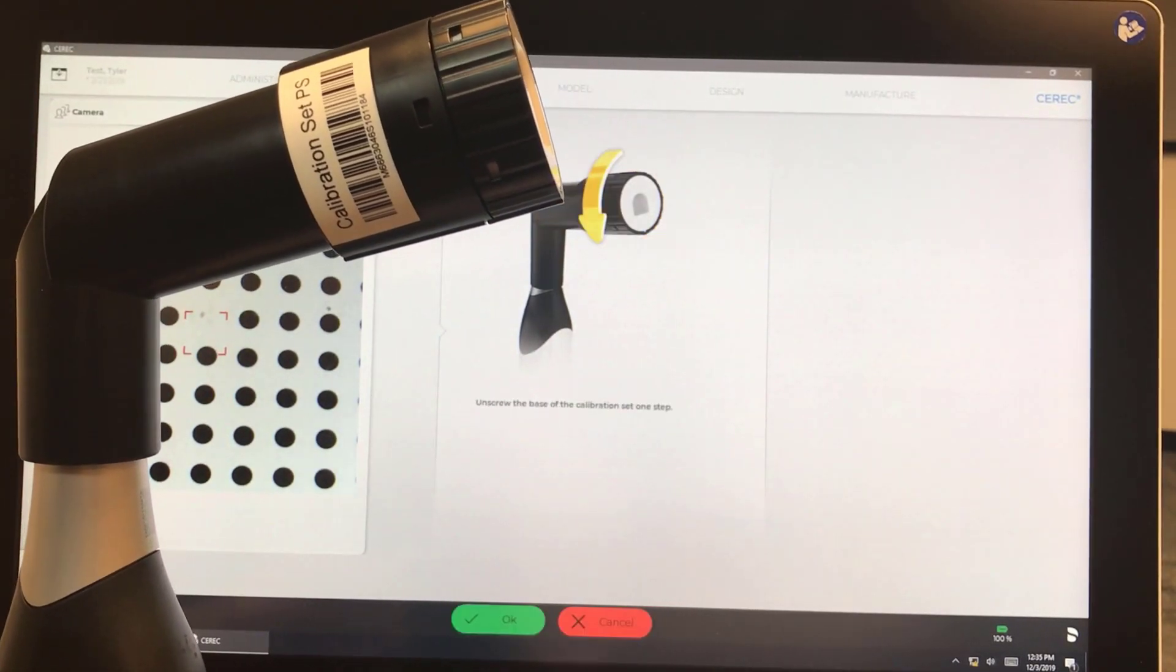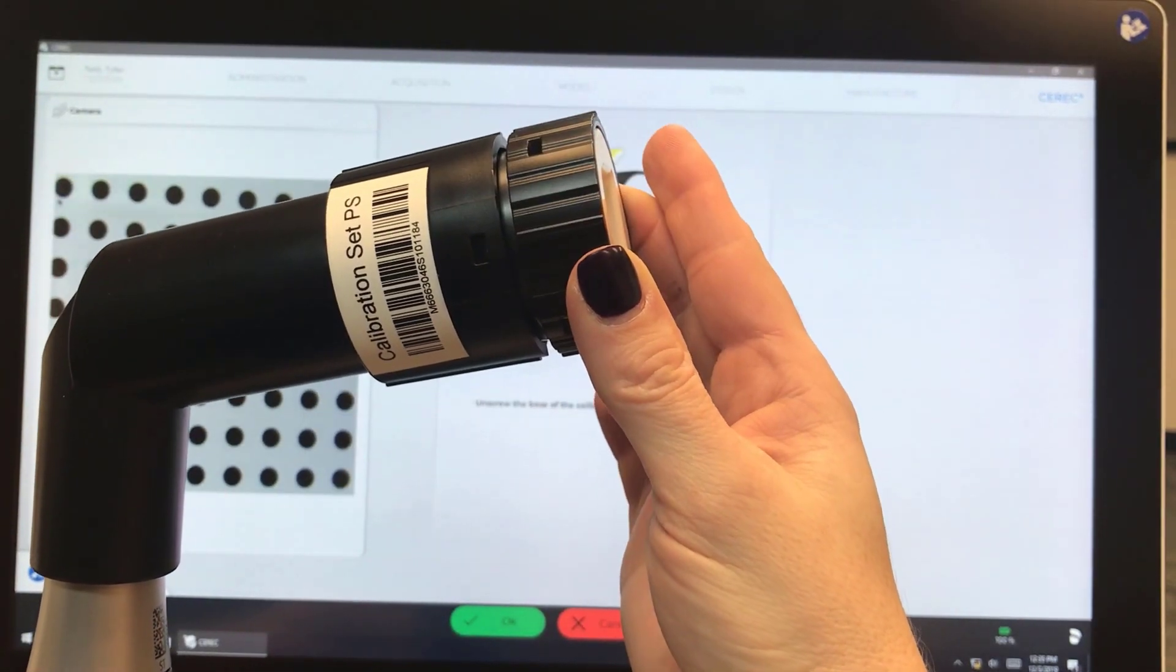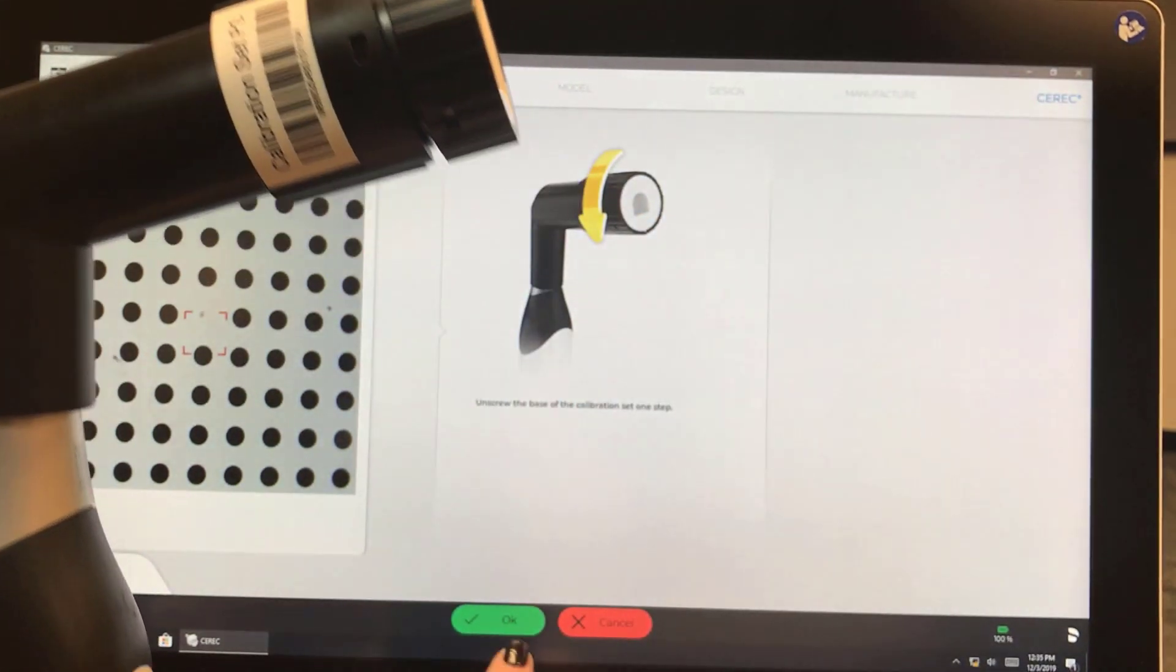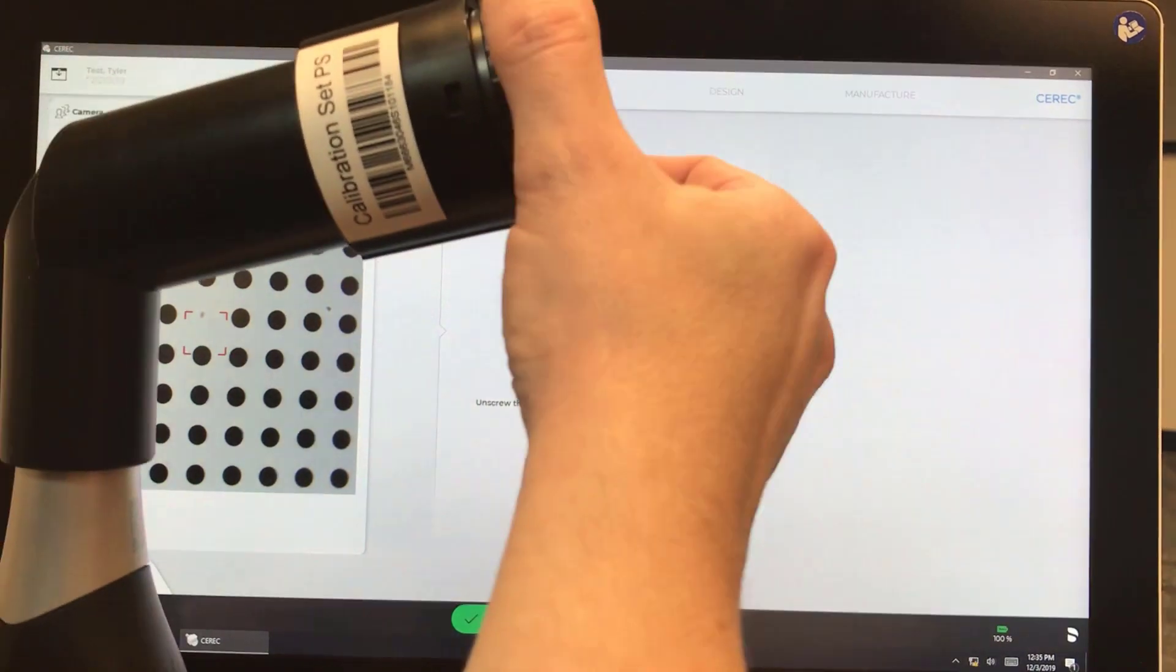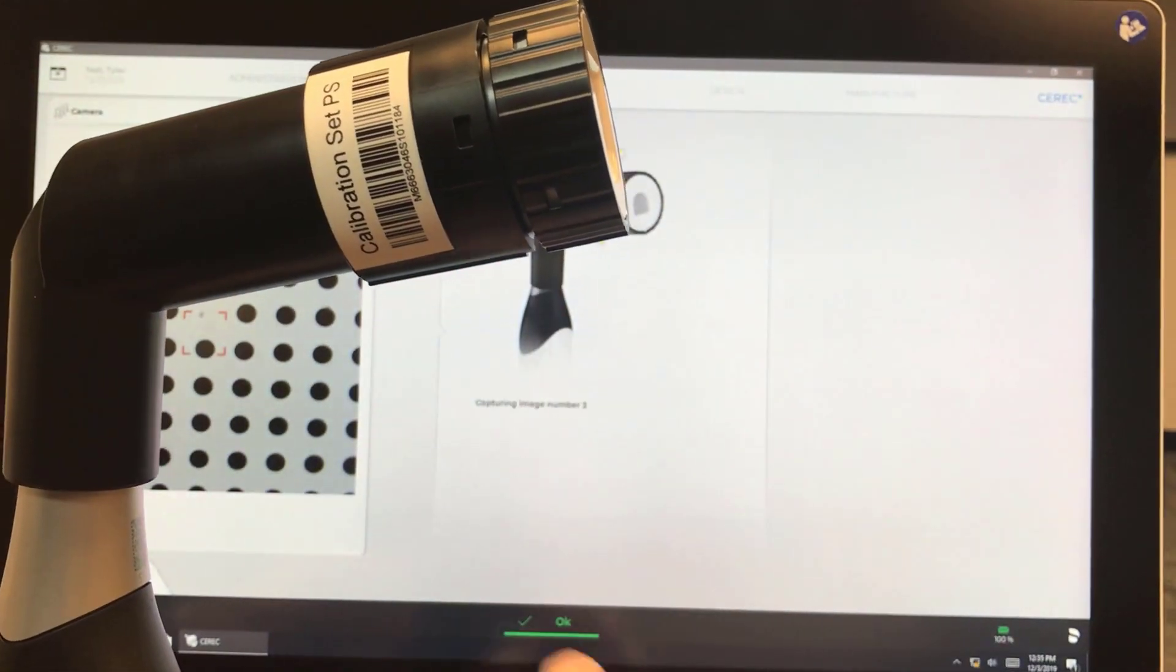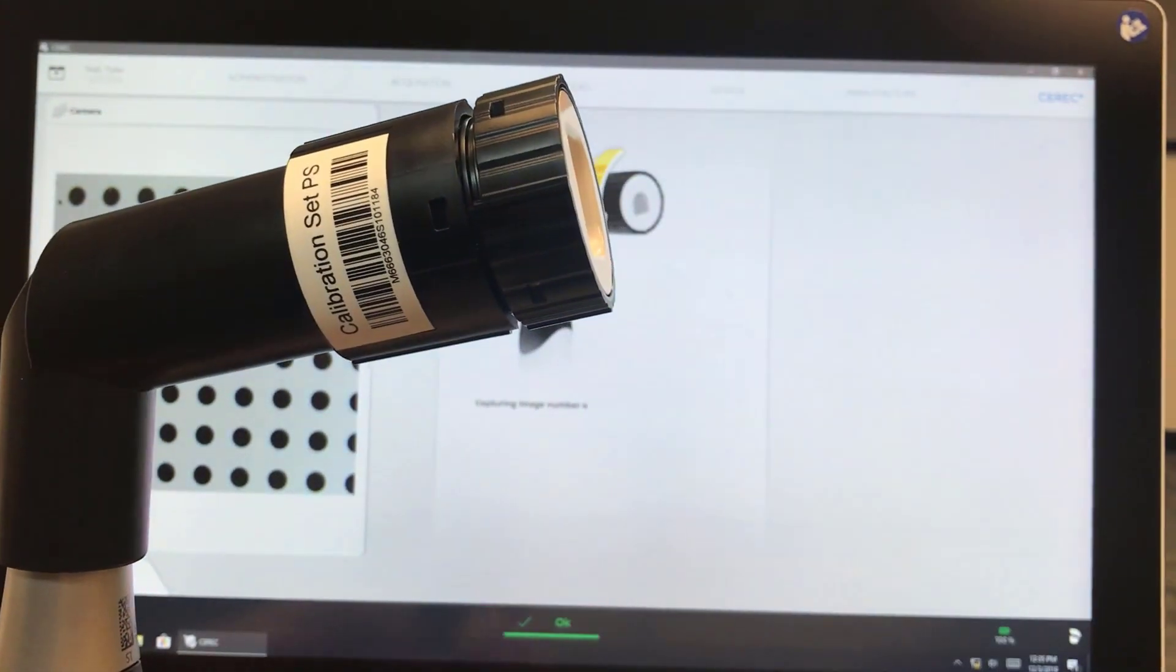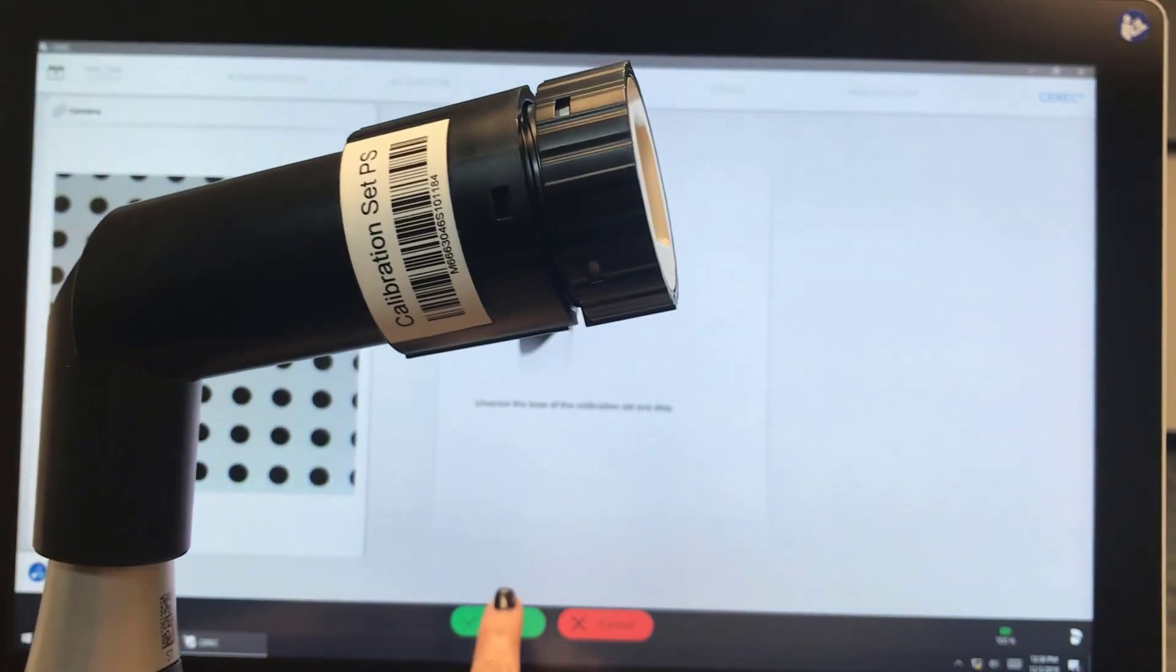And we're going to unscrew one step. And you can hear the click. And you hit OK. And it tells you that it's capturing the next image. And we're going to do this 17 times.